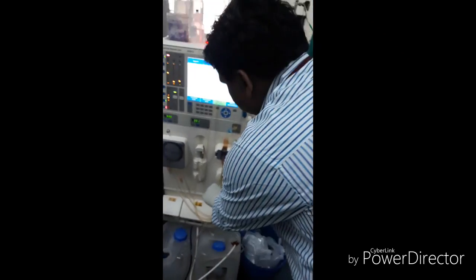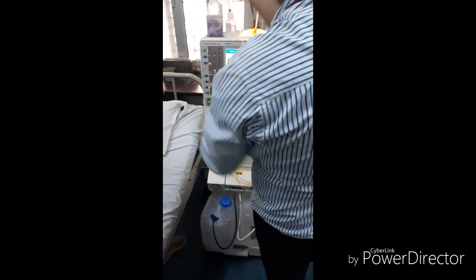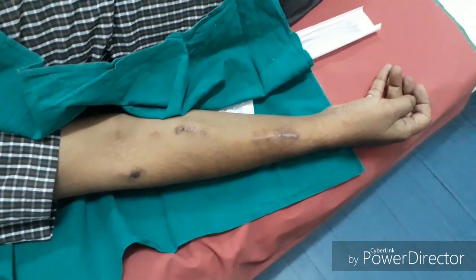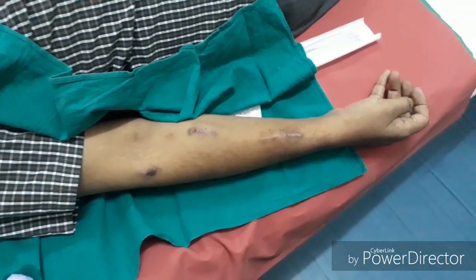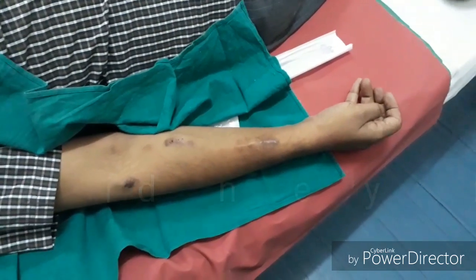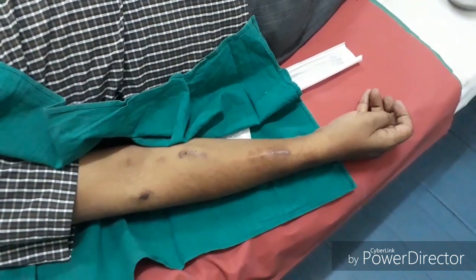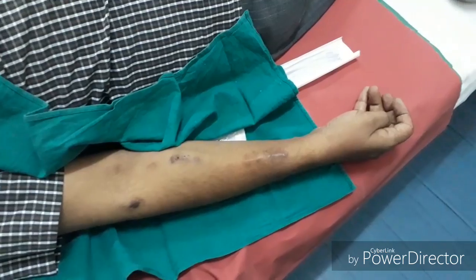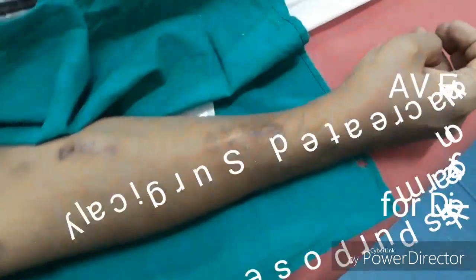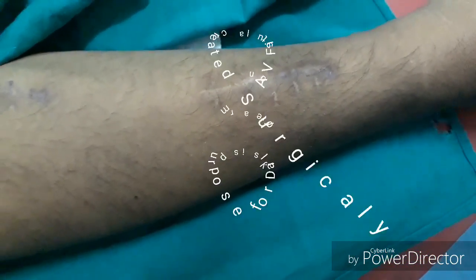Within a few minutes we are going to start the process of hemodialysis. In the patient of chronic kidney disease, dialysis is done — CKD ke patient mein hum dialysis karte hain. The prime requirement for dialysis is the presence of an AV fistula — an arteriovenous fistula — which is a combination or union of an artery and a vein. Without this fistula it is not possible to do dialysis.